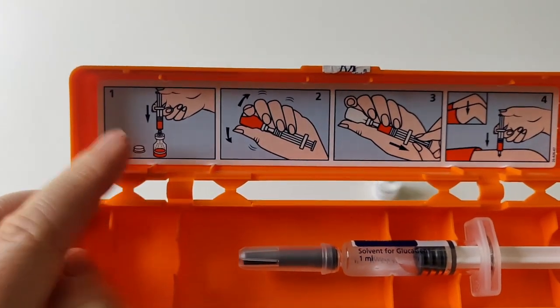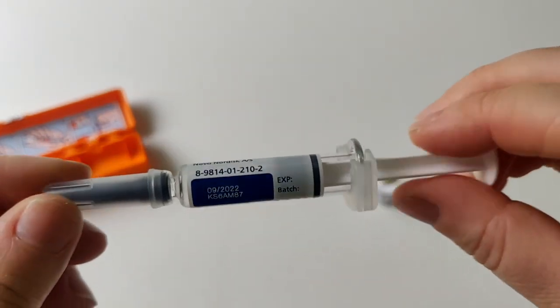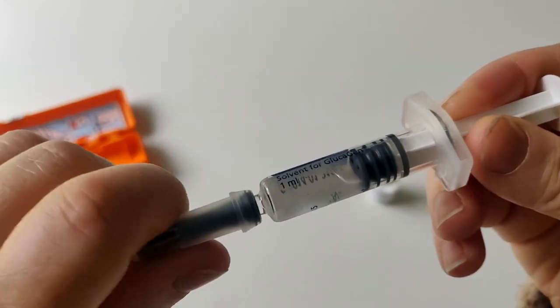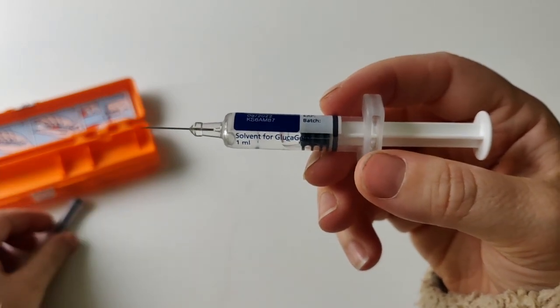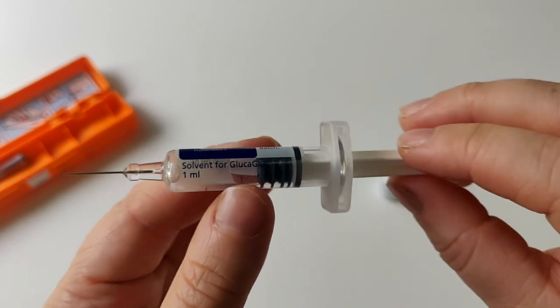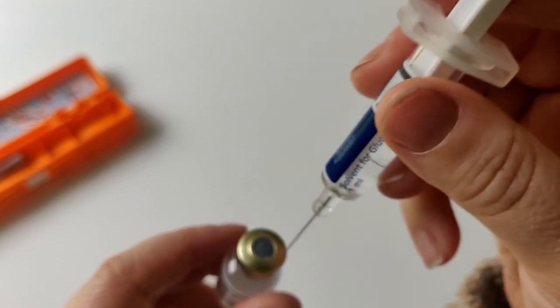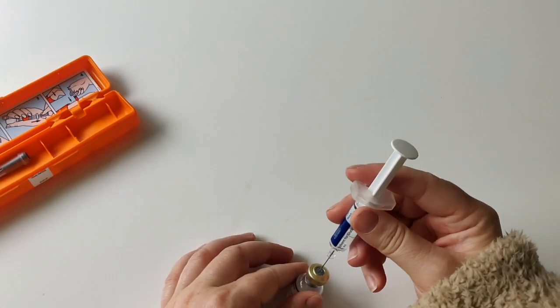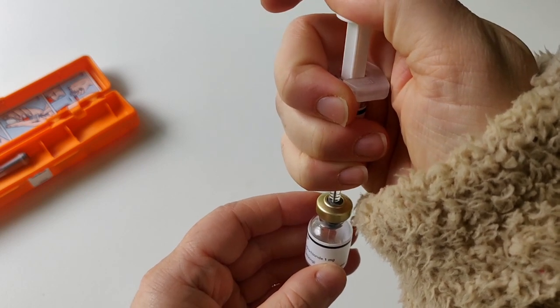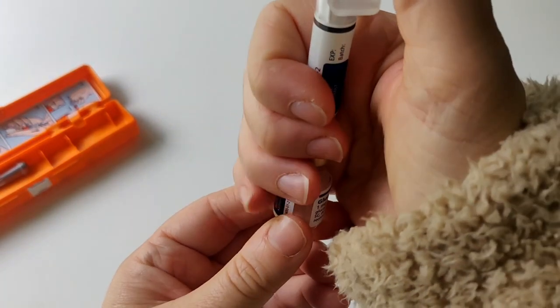Now take the syringe — remember this one is out of date, so make sure yours is in date. Take off the plastic lid. Be careful, as it's an extremely long needle, much longer than any insulin injection. There is a marked circle on the stopper — that is where you push the syringe in. It pops in like that. Hold them together and push down, injecting all of the liquid from the syringe into the vial.